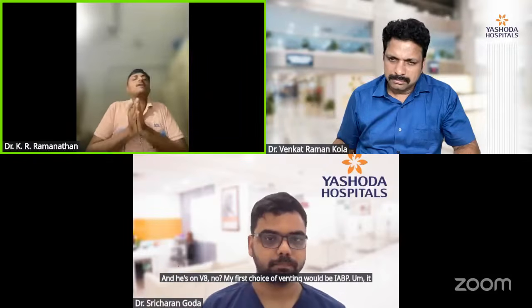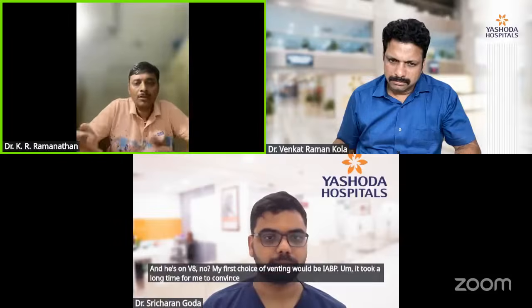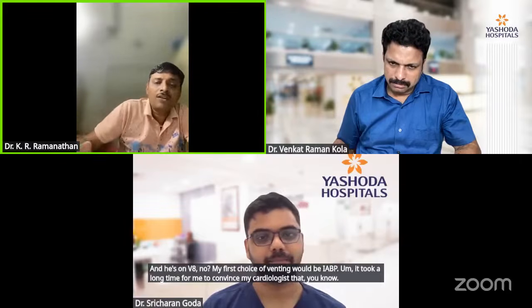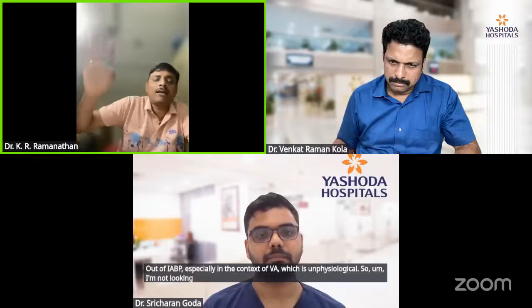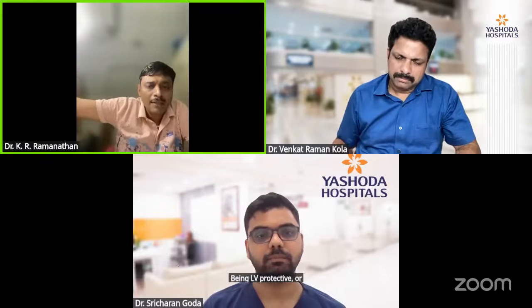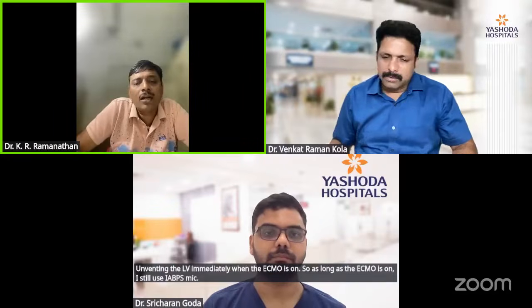It took a long time for me to convince my cardiologists that these patients do benefit from IABP, especially in the context of VA ECMO, which is unphysiological. So I'm not looking here at IABP being LV protective or 28-day mortality protective. I'm looking at unloading the LV immediately when the ECMO is on. So as long as the ECMO is on, I still use IABP as my first MCS.